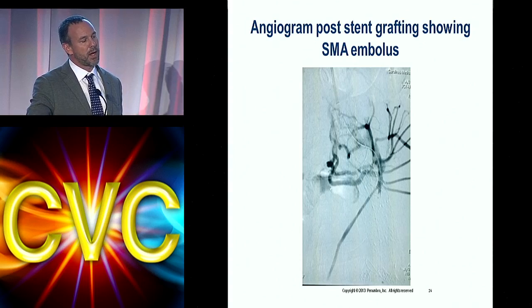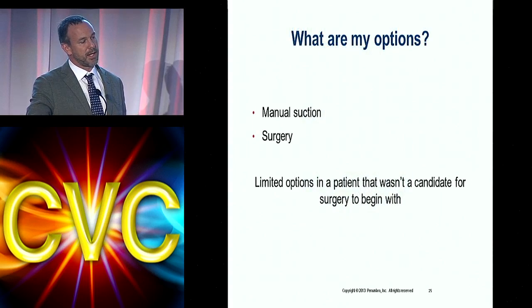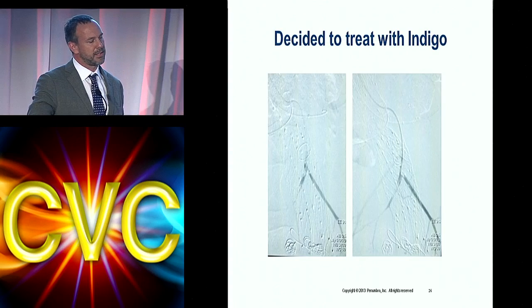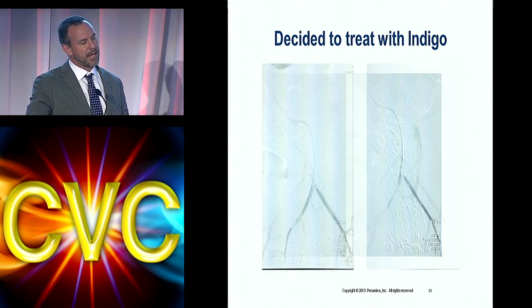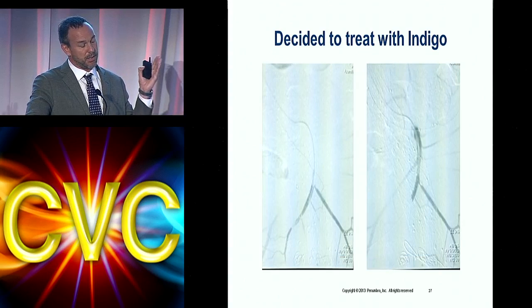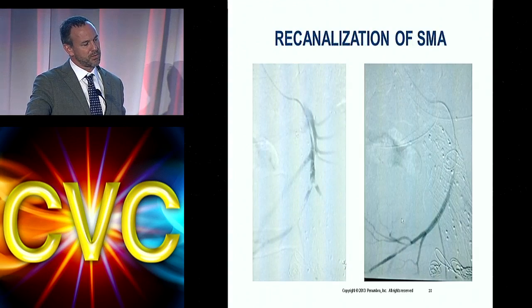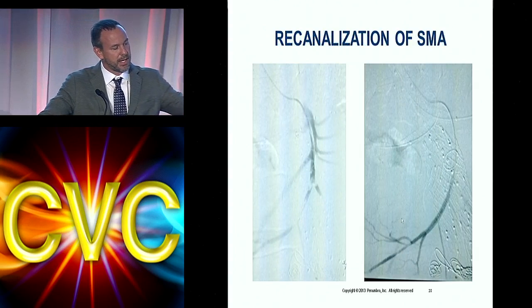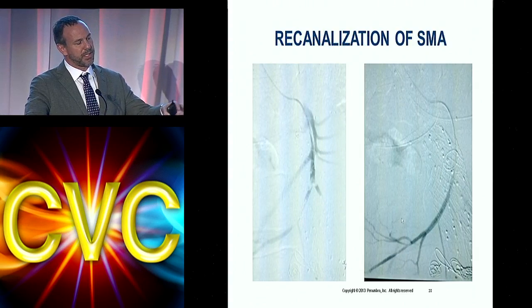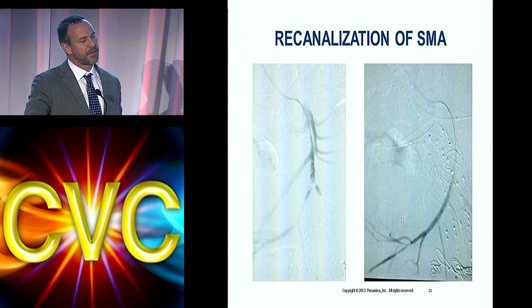I actually already had a wire down there and went down with the catheter. Here you can see thrombus down that digital branch. Went down with the Cat 5 and sucked that out. Again, here you can see that abrupt break-off with the actual thrombus. That was one pass, so I cleaned it up quite nicely, but I still have some stuff down there right at that bifurcation. Went down with another pass, and now you can see my runoff is nice, clean, wide open.